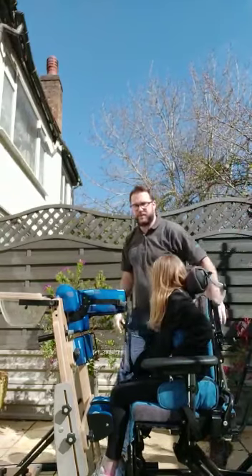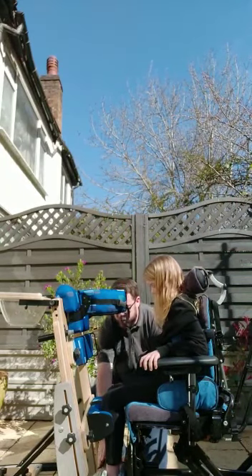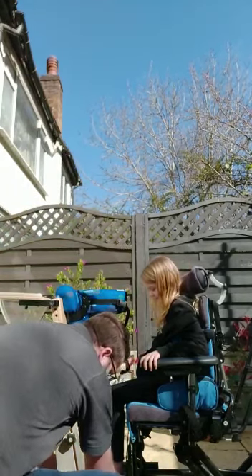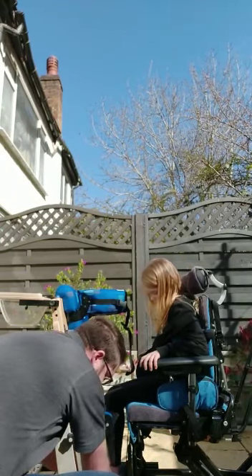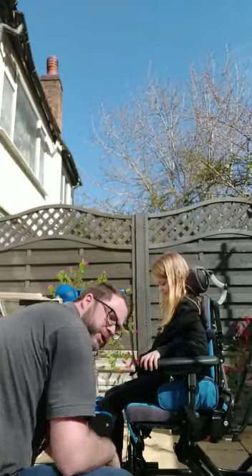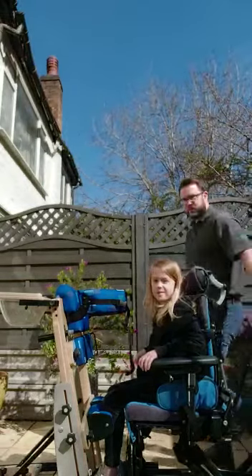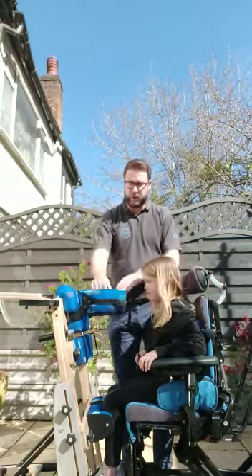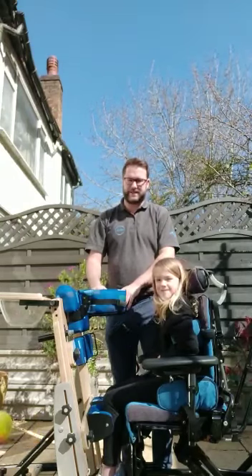What I tend to do is get your child's feet in first. You can use the straps and do up the straps first. Make sure you do all your straps up first. Then you'd come from the side. If your child can help facilitate, this is what you would do. If your child can't facilitate a standing transfer, you would use a hoist with a standing sling.